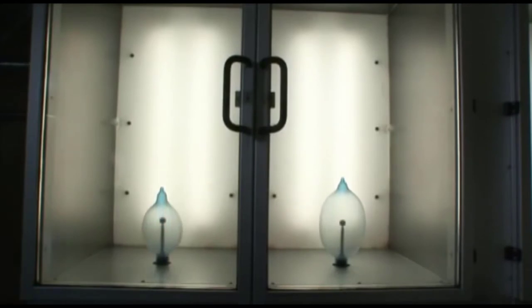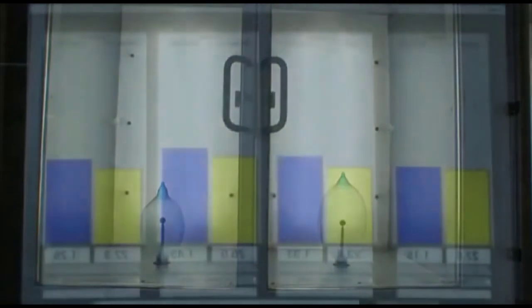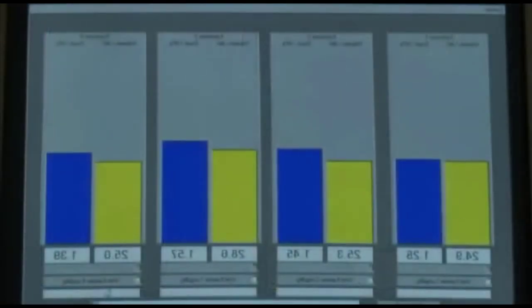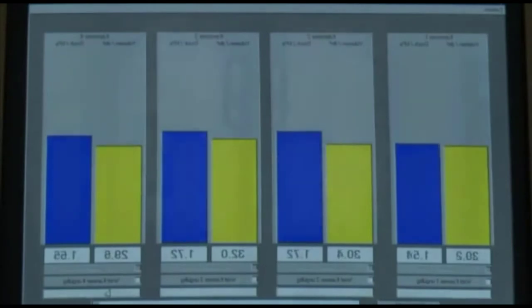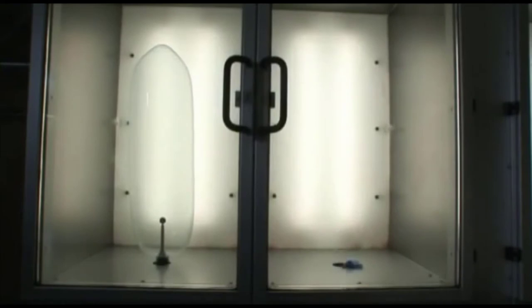Thus, the international standard ISO 4074, for instance, requires that spot checks are made ensuring that the bursting volume of a condom, after an artificial aging process, respectively until the actual expiration date, must amount to at least 18 litres. All MAPA-quality condoms exceed this threshold by far.